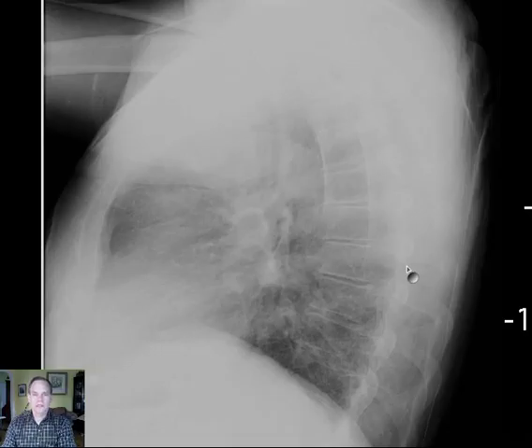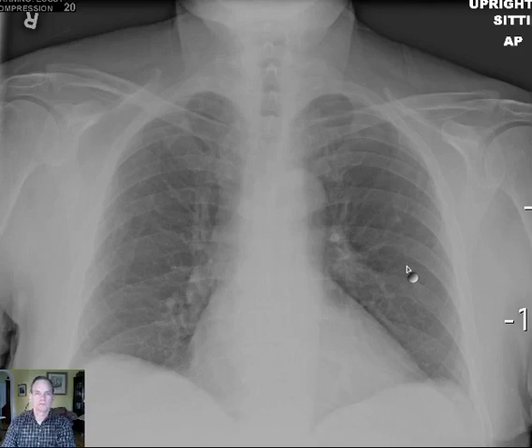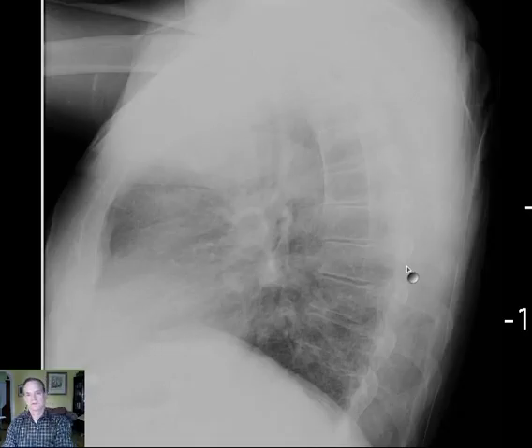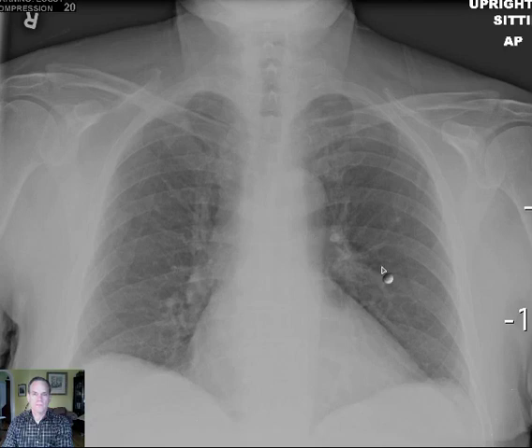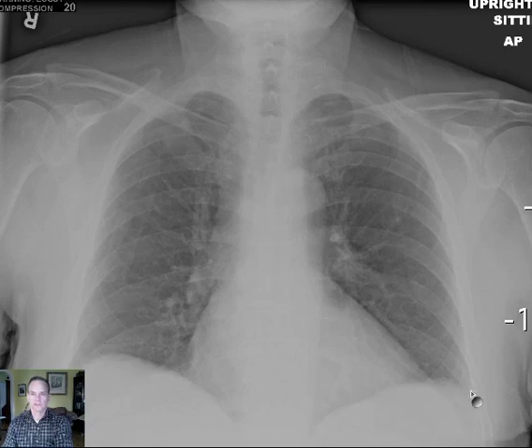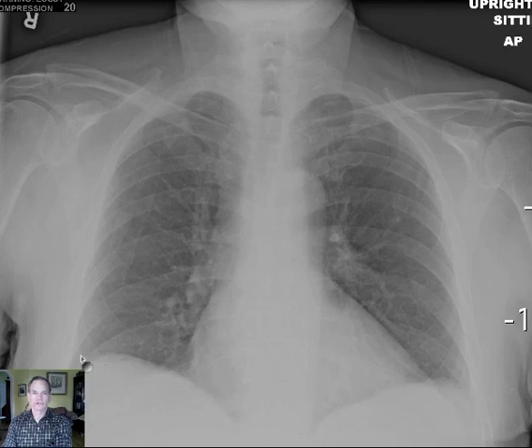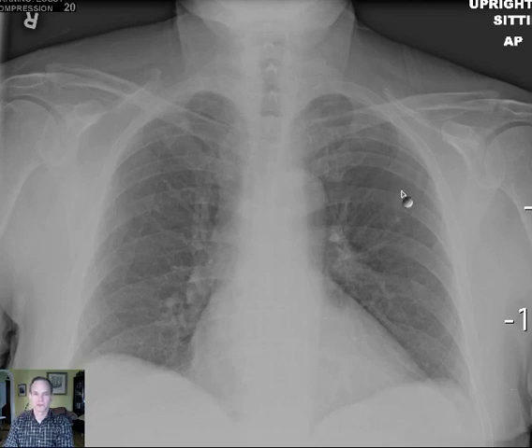To me, it looks pretty unremarkable. I don't think there's anything there I would call. You look at the hilar regions, they look pretty good. Lungs are clear. Diaphragm is well seen. No silhouetting. Costophrenic angles are sharp. Pulmonary vasculature appears unremarkable. Bones look fine.